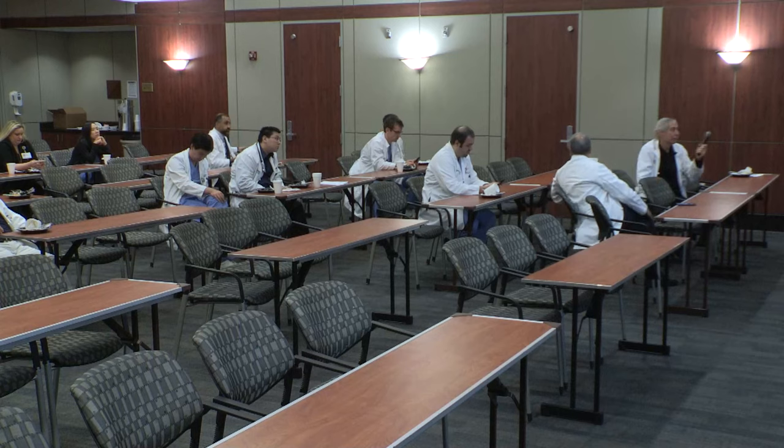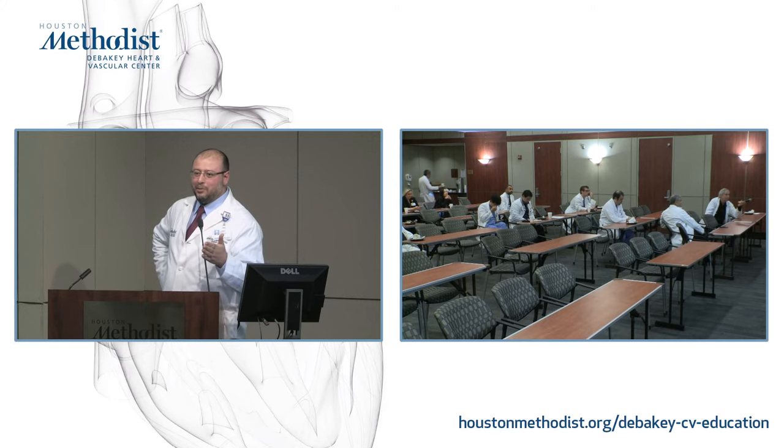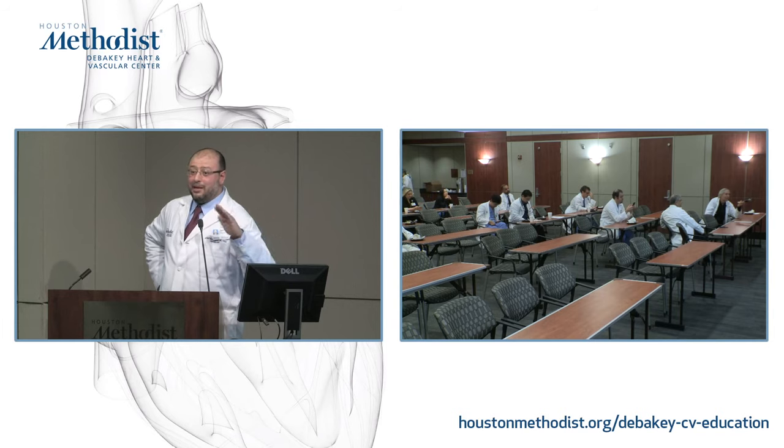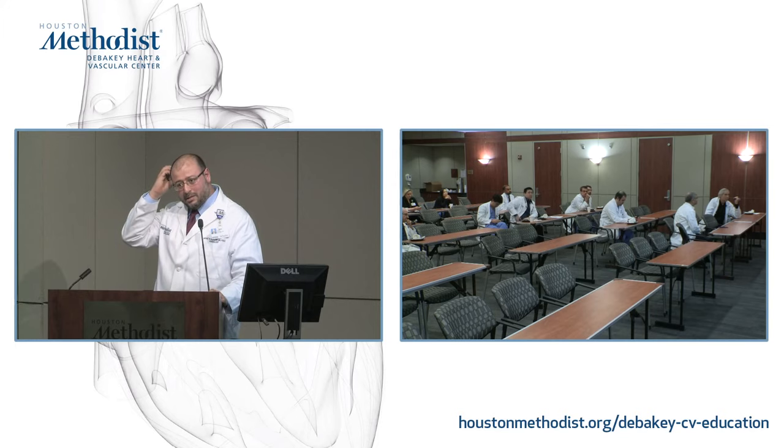No, I agree. I think on the digital system, there is not such a... But when I was in fellowship, we were actually validating rubidium against ammonia. A patient would come to Brigham, get a rubidium study, then go to MGH, get healthy volunteers, and get an ammonia study. That is where most of the data started with rubidium. But now with the 3D system, this digital one, I fully agree with you that we don't have that much data comparing it with animal models for perfusion, or at least microspheres, or to the other 2D systems.